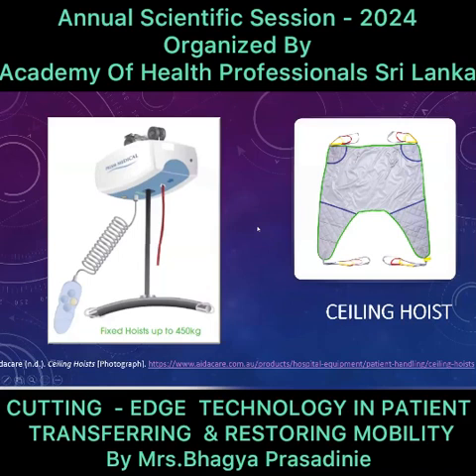Yes, so next we are moving on to the transition from a bed to the chair. So in such cases, we use ceiling hoists. This ceiling hoist needs to be put up on the ceiling. So there is a specific track which the machine goes, and it's all power controlled.